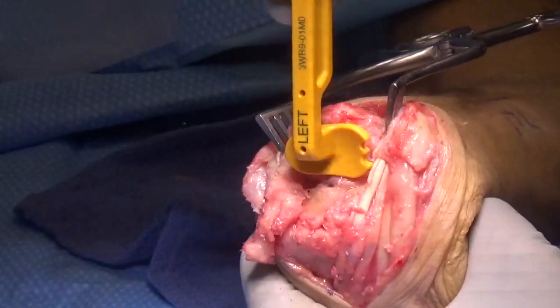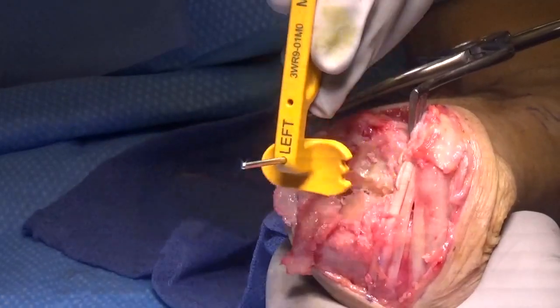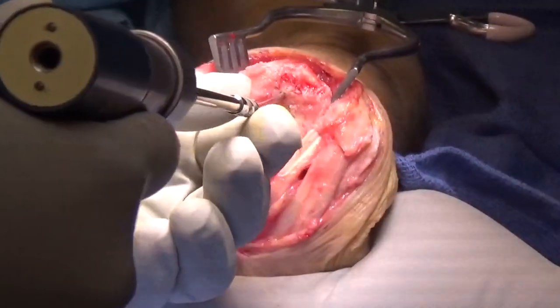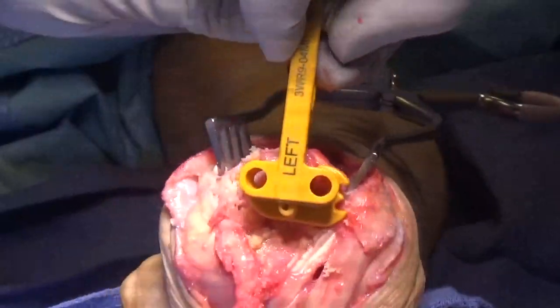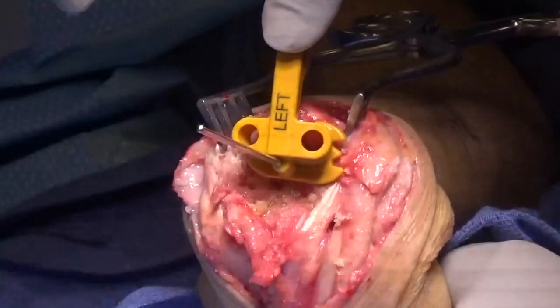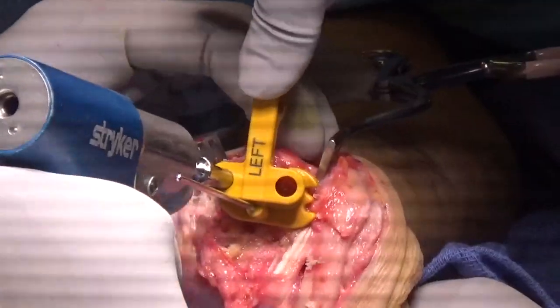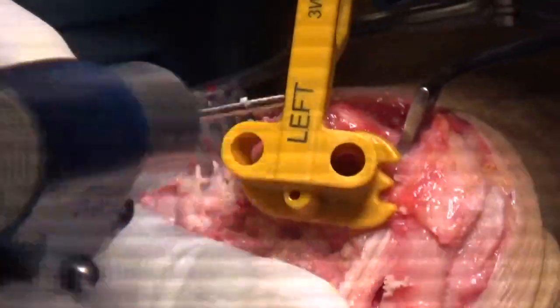Next, with the radial drill guide, the carpus is measured. In this instance, a size medium distal radius component will be used. A guide wire is placed down the central axis of the radius, and then a cannulated drill is reamed. The radial V guide is placed, provisionally pinned, and the radial and ulnar core drills are used. They are then removed, and with the rongeur, the drill holes are connected together.